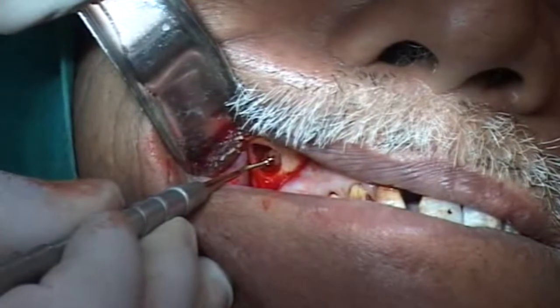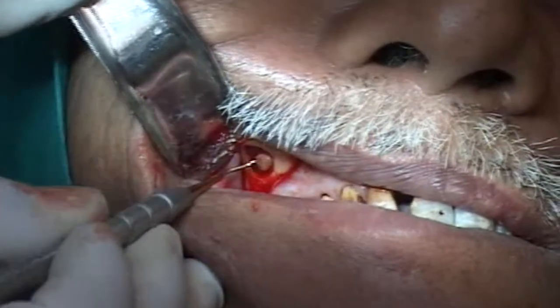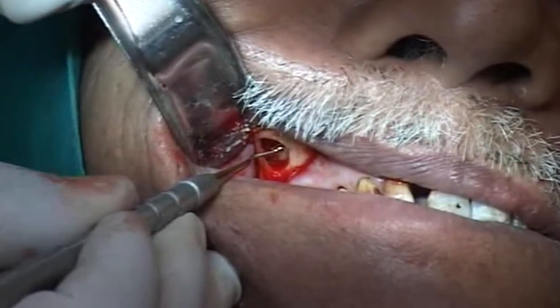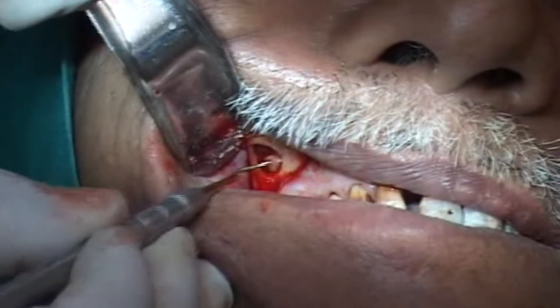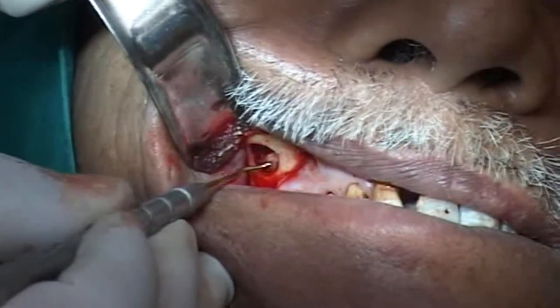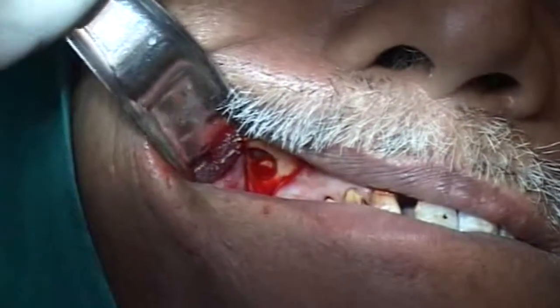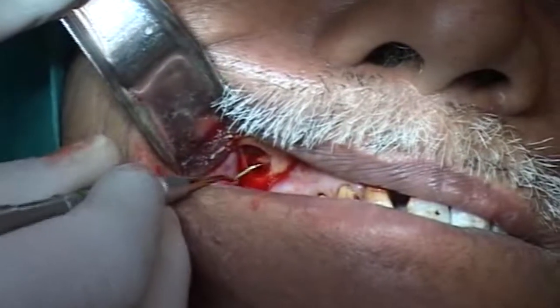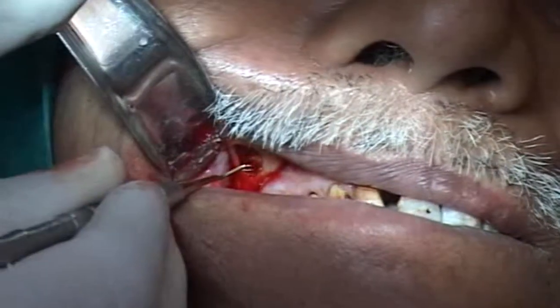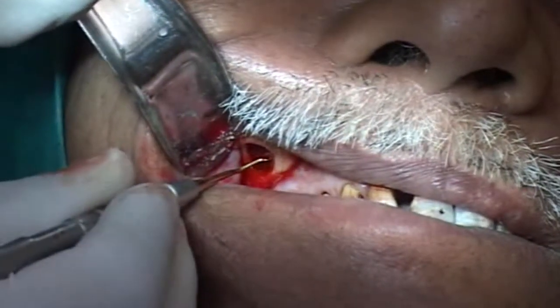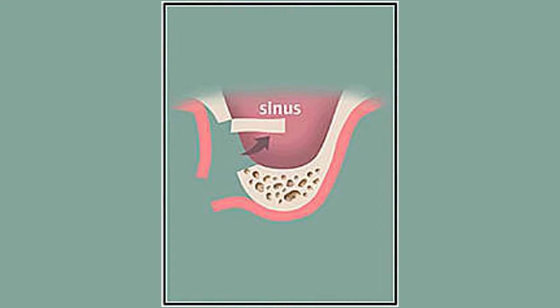The surface of the maxilla is very uneven inside the sinus, and this breathing maneuver is the only way we can have a controlled reflection of the schneiderian membrane. Remember, we want to reposition this small bone piece — which is vertical now — horizontally deep inside so that we can rest it on the implant.